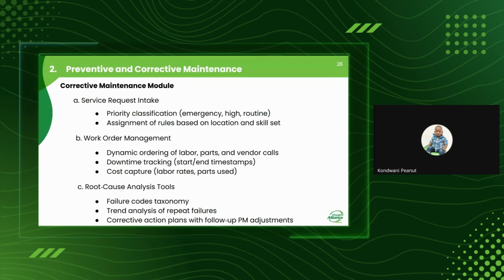Of course, in some books, they will differentiate to say repair is more of what we do when equipment is broken down, but corrective is more like bringing back the deviated performance of an equipment. But they really mean the same thing. Only that some books will choose to differentiate to say repair is more of bringing back an equipment which is completely down. So in some books they would specify repair as bringing back an equipment which was completely down.